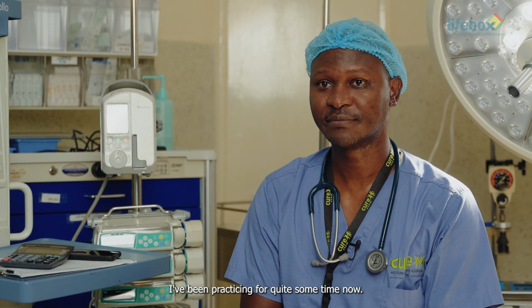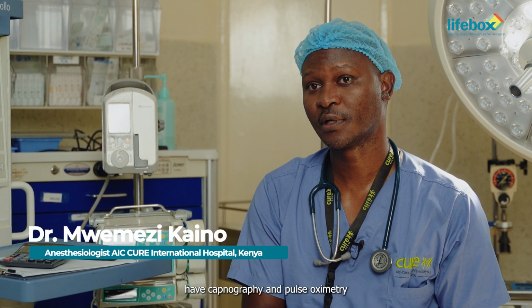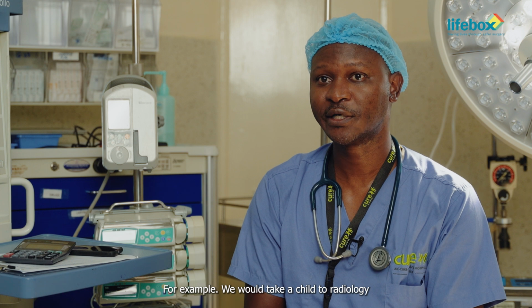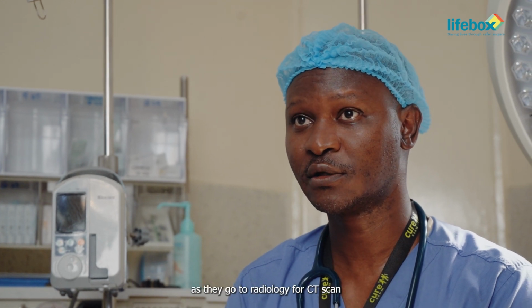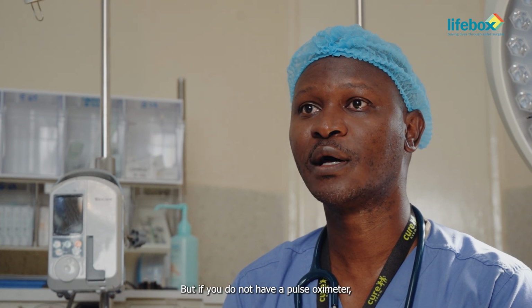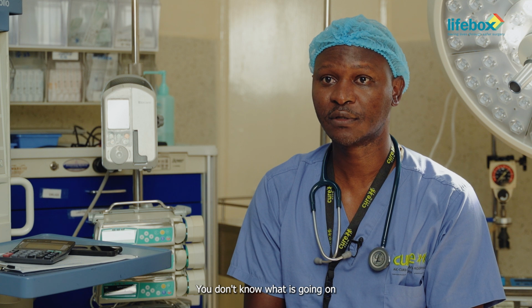I've been practicing for quite some time now. There are moments when we did not have capnography and pulse oximetry, all right? And bad things were happening. For example, we would take a child to radiology for CT scan, and children need to be sedated as they go to radiology for CT scan. But if you do not have a pulse oximeter, then you are blind. You don't know what is going on with regard to oxygenation and ventilation of this patient.